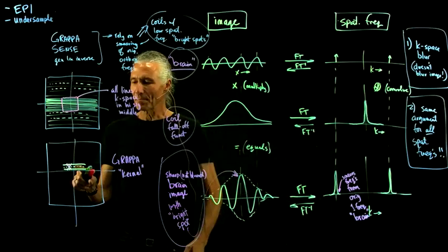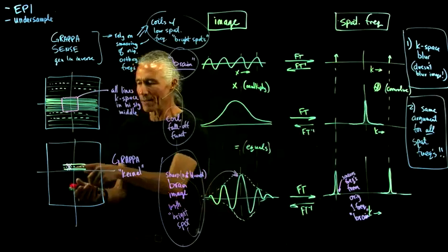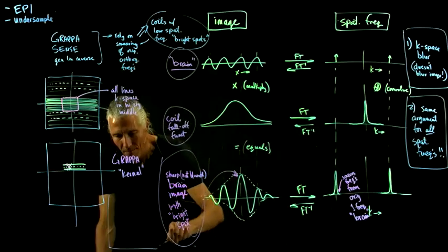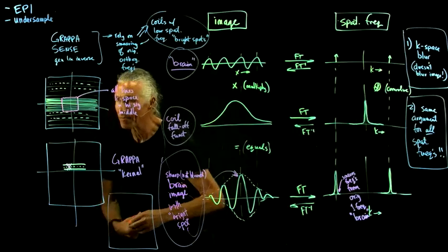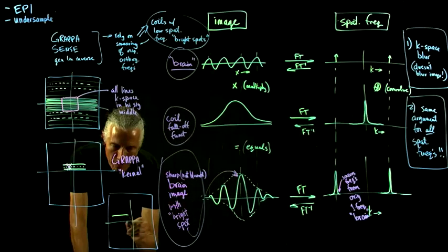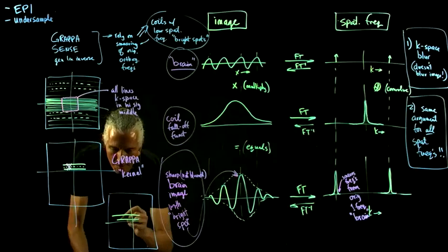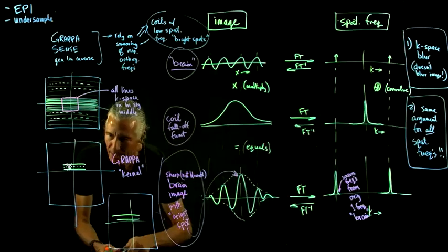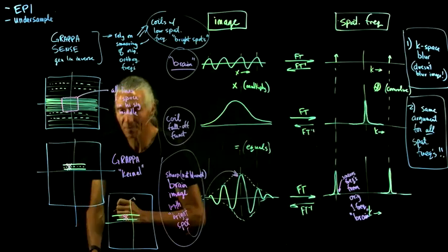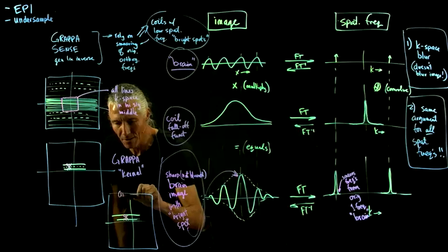And in fact, you have even more data than just this one slice, because we've got another slice over here, from a different coil, and with that different coil slice we can do the same thing. So what we can do is take that same point and try to predict what that point should be from the other slices too. So this is another coil K-space.